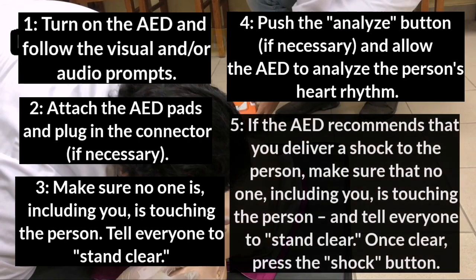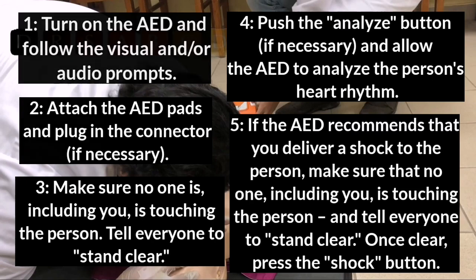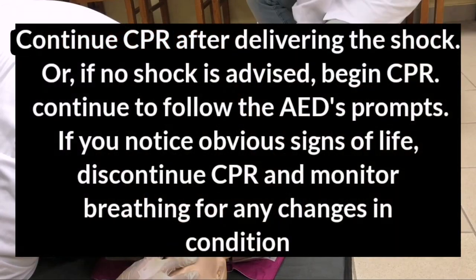If the AED recommends that you deliver a shock to the person, make sure that no one including you is touching the person and tell everyone to stand clear. Once clear, press the shock. Continue CPR after delivering the shock. Or, if no shock is advised, continue to follow the AED's prompts.